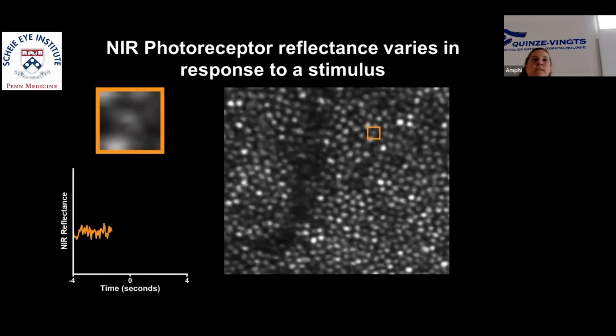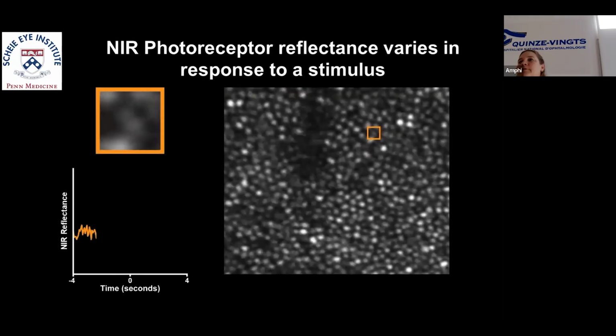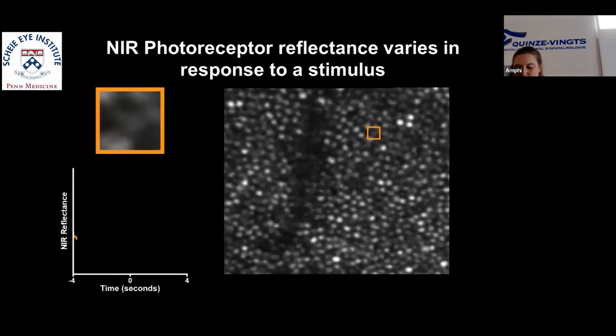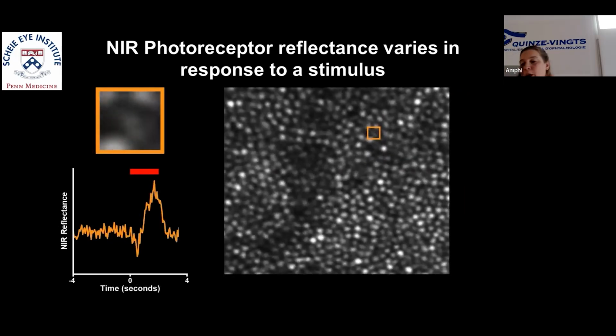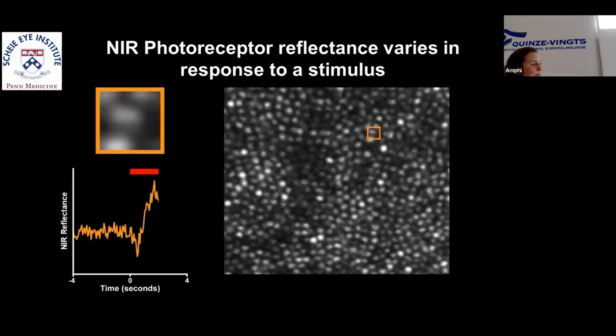So my team uses adaptive optics scanning laser ophthalmoscopy. And so I'm going to describe the results that we get using that technique for this optoretinography idea. So this is a video here. I really hope it's playing well through Zoom for all the folks online.